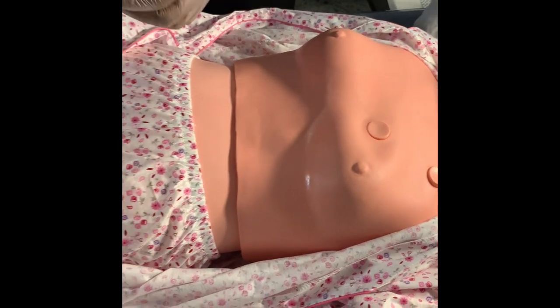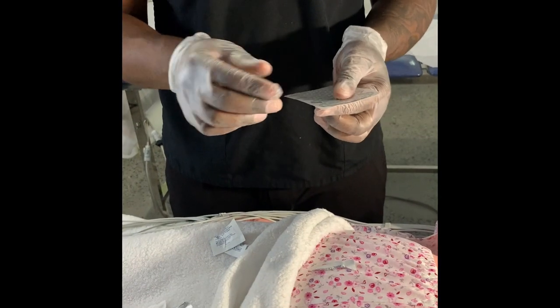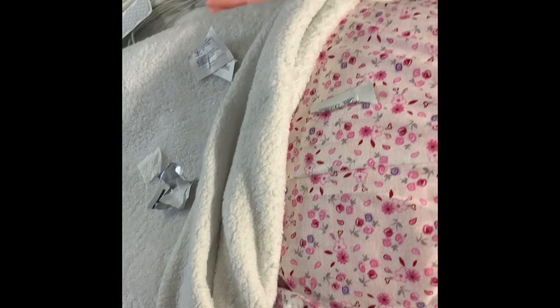There are different areas you want to clean — you clean the chest and you clean the arms. Make sure when you're doing this that you place the electrode stickers on the patient in the same area. They have to be on the same level, pretty much balanced — bilateral on both sides. One shouldn't be high up on one side while the other is all the way down on the other side. They need to be on the same level.